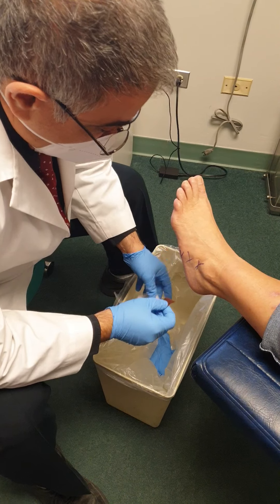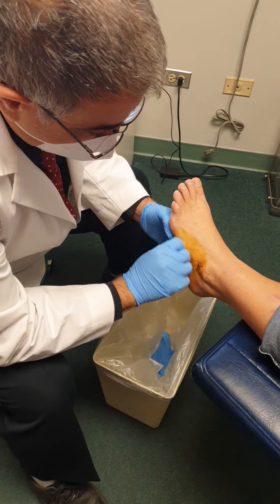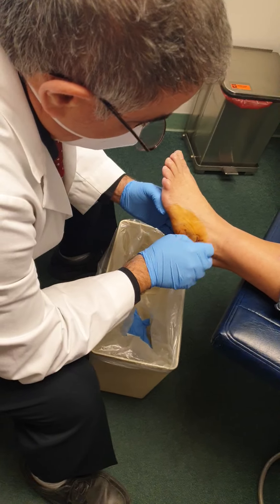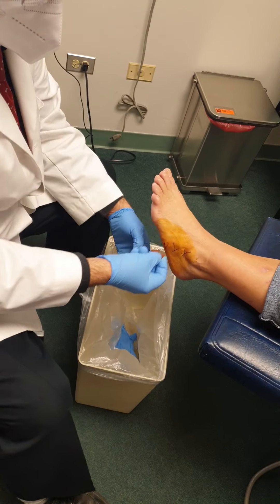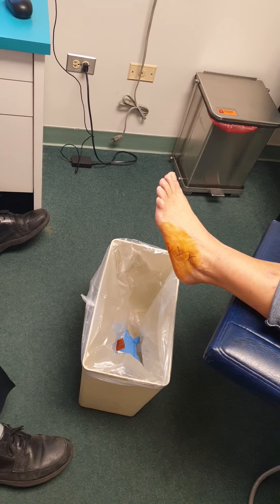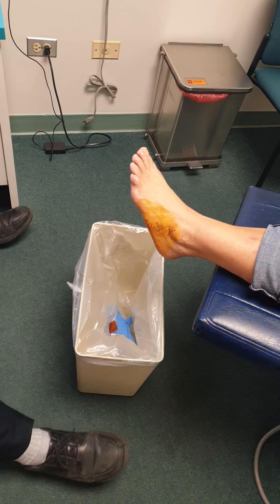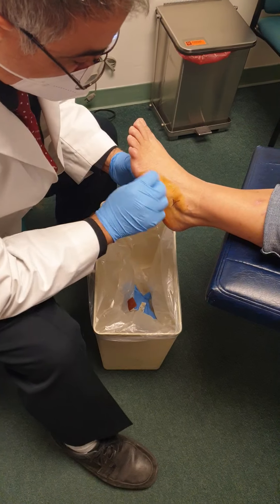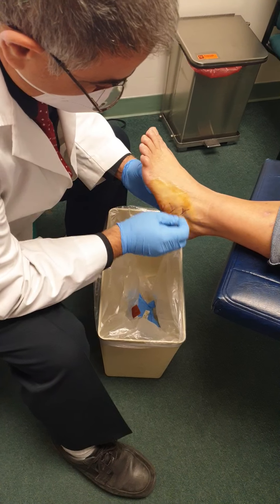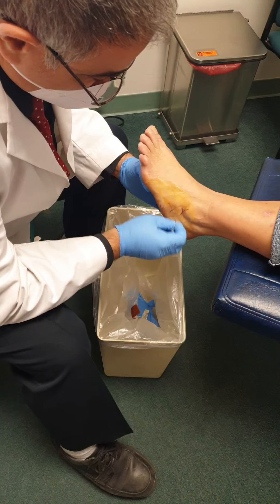Usually the best thing is to just do a little bit of betadine — that gives the patient an instant tan, see? And then a little bit of alcohol after that. This way when I inject it, it doesn't cause a tattoo to the patient.